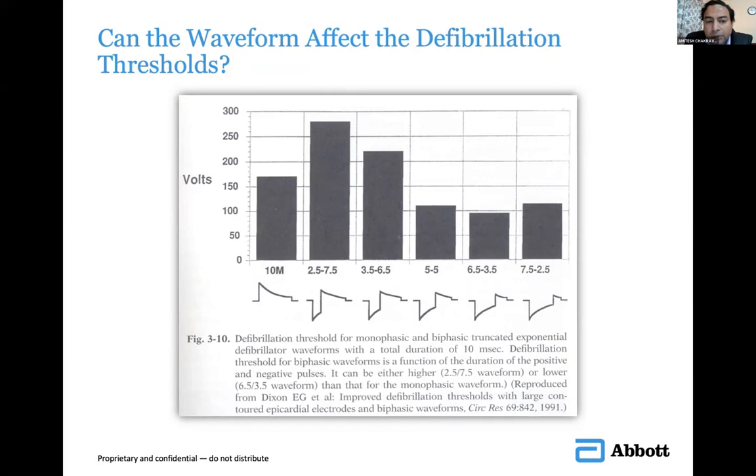It is a circumstance where your defibrillation might just fail. But after two, in fact they say between two to three, you are probably not looking at a successful cardioversion or defibrillation, except in cases of VF, where you will be looking at a larger number of shocks. But in cardioversion, if it's more of an elective case, you don't give more than two or a maximum of three, under IV amiodarone or IV beta blocker, or sedation. Whatever you want to do, you stay put at a maximum of two or three. That's it.